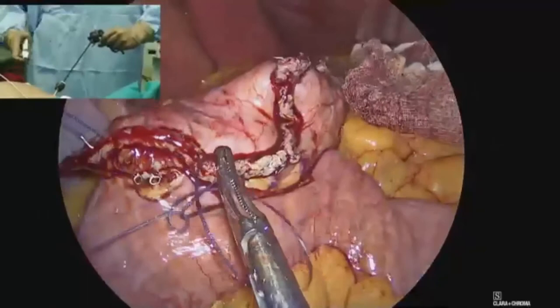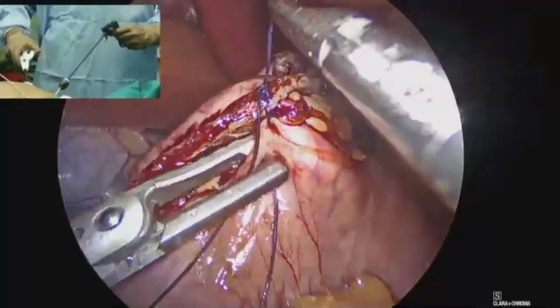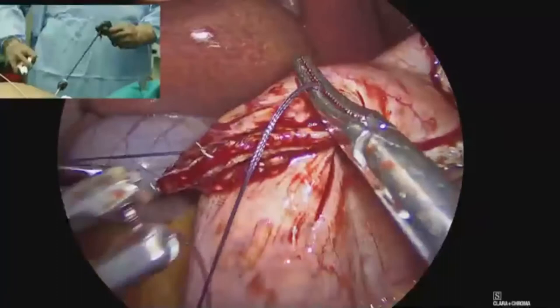Now, for example, this liver is not as bad. It's a fatty liver, but not cirrhotic per se. For example, the last case, which I did just before this VBU started, was supposedly a gastric bypass, which I had to do as a banded bypass, but we entered inside and the liver was badly cirrhotic, although nothing was reported on the ultrasound scans. It was just mild fatty liver.